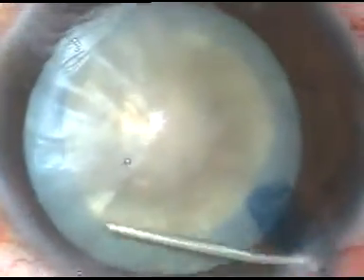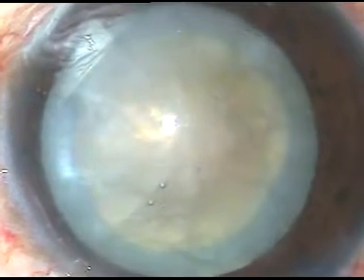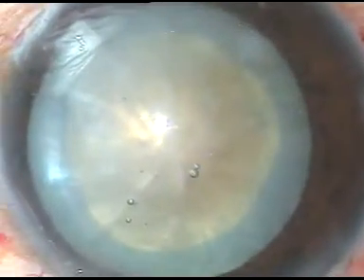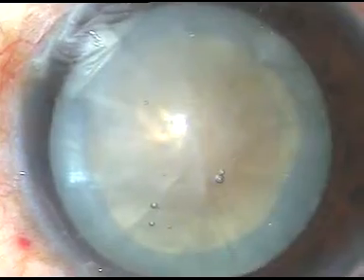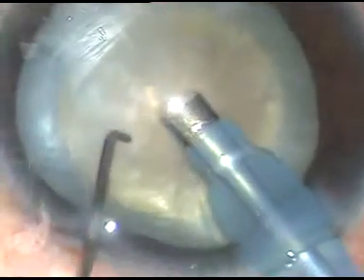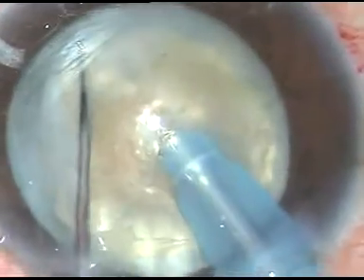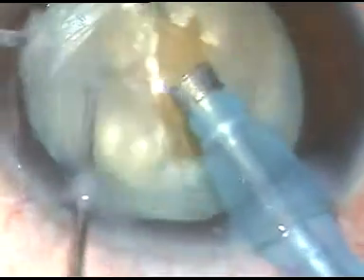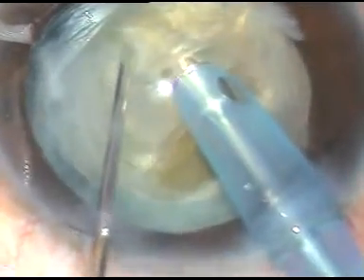Hydrodissection is done — a little bit of hydrodissection — the nucleus is depressed slightly, and I try to rotate the nucleus after injecting some viscoelastic substance. In this case I didn't try to rotate the nucleus. See how this cataract looks — it is harder than the previous cataract, likely a grade 4 nuclear sclerosis. I try to chop the nucleus but the fibers are leathery and there is a posterior plate which resists this direct chop.